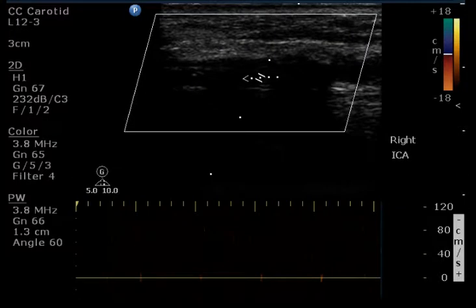Here we have a pulsed Doppler gate in a portion of the vessel, and we see no flow at all. Now this gate is fairly small. It would make sense to open the gate from wall to wall to show if there's any flow within that larger area being interrogated by the pulsed Doppler. So technically, the sonographer probably moved this gate all over the place looking for flow, but opening it wide, perhaps a full centimeter of Doppler gate would be more convincing that there is no flow in the ICA, that there's total occlusion.